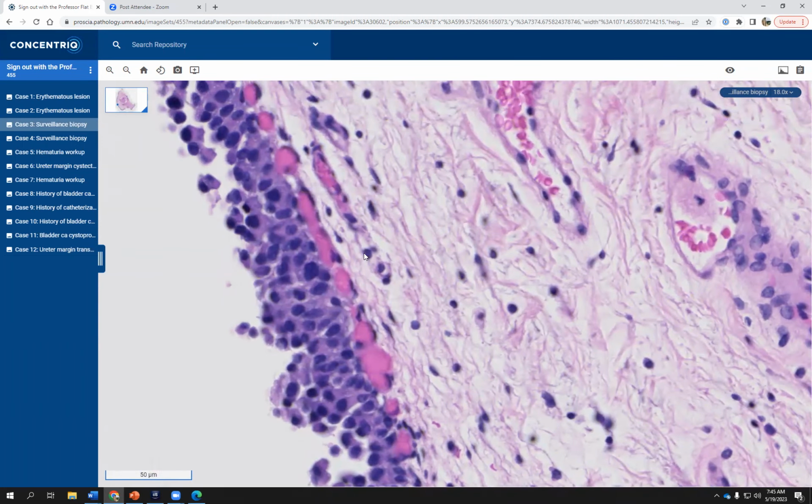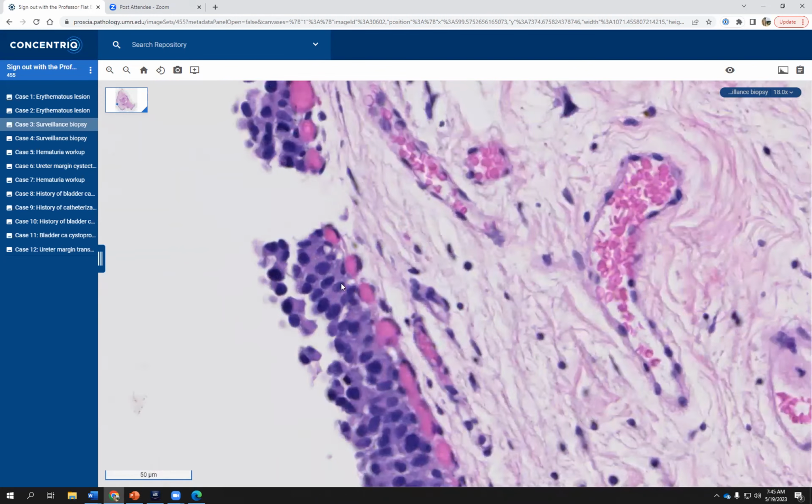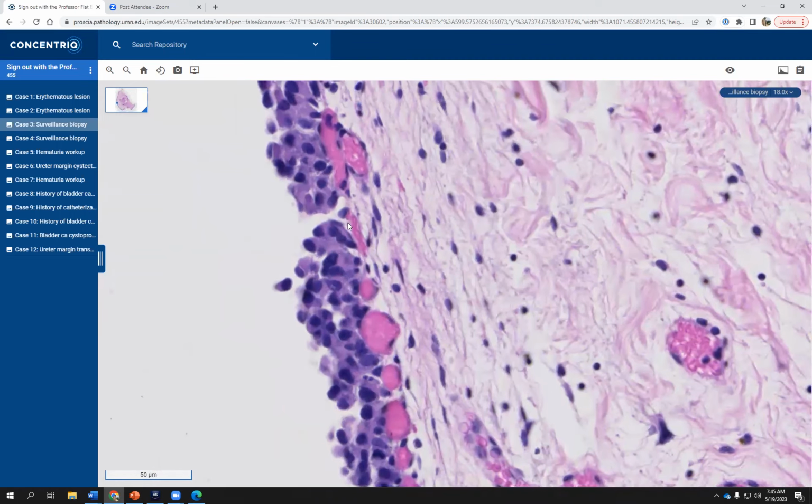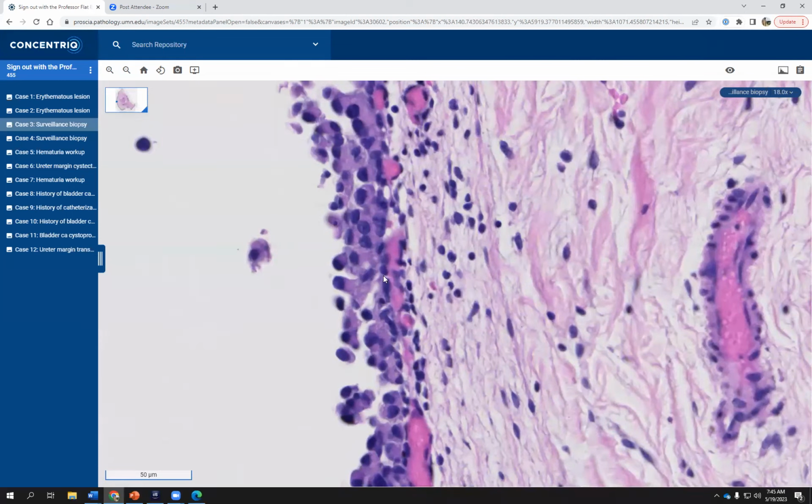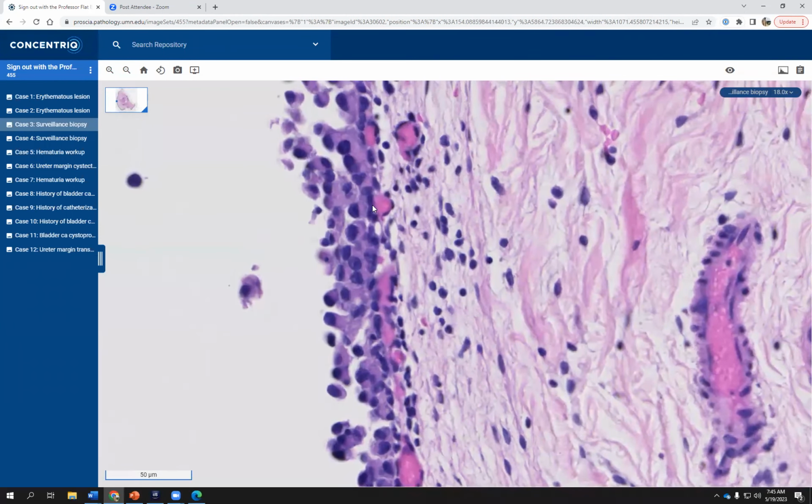So you will find that the nucleus of the tumor cell is at least 3 times the size of the lymphocyte nuclei. So you can put more than 3 lymphocyte nuclei over here. In many places, you can see that type of change. So there's a lymphocyte over here. So you can easily fit 3 lymphocytes in here.